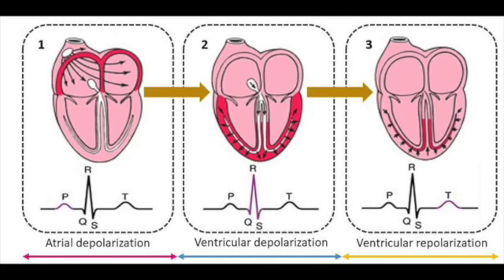All right, so then our ventricular depolarization is going to be our QRS. And I think it's very important that you look at where these waves are. These Q waves, this R wave, this S wave, looking at where that's at. Now what's happening in ventricular depolarization? Well, now it's traveling down the ventricles, the septum, and across, all the muscle cells around the ventricles. And we have a good image of that right there.